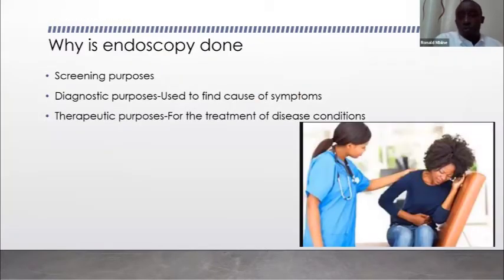So why do we have to have this procedure done, uncomfortable as it looks? First, I need to mention that endoscopy has significantly transformed the management of gastrointestinal diseases. We need to thank God that there is a modality such as this, because without endoscopy, medical care of gastrointestinal diseases is completely blind. You're going to have people presenting with the most advanced form of diseases. But with a simple procedure such as endoscopy, we've completely turned the tide of gastrointestinal care.